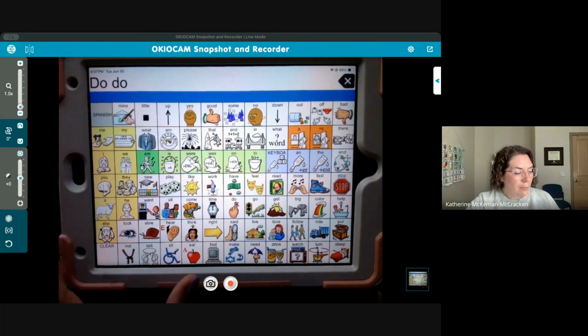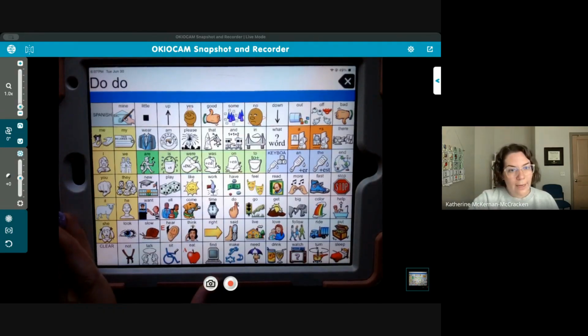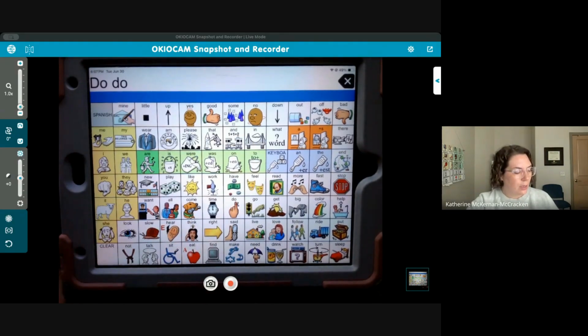So LAMP always has 84 buttons. And you can hide some of the buttons. They have other vocabulary sets where you can do 2 hits to say a button or 1 hit. But really, I think to build that complete motor plan of the entire movement to say the word, LAMP Words for Life Full is a great way to go.